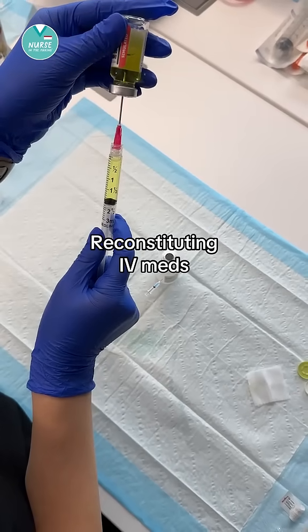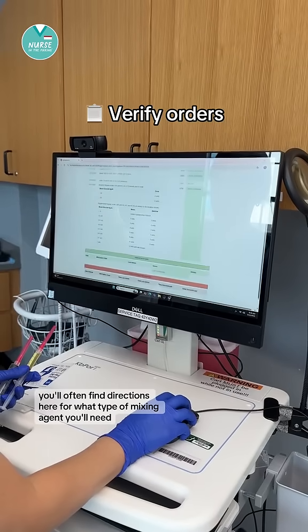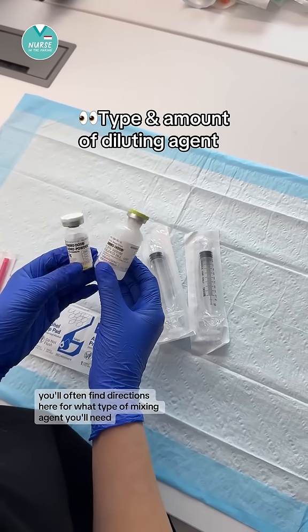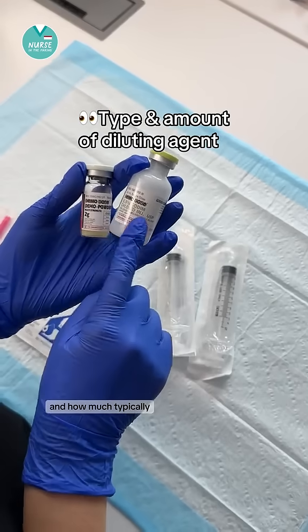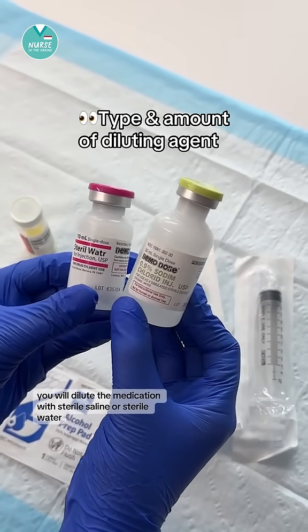Let's reconstitute IV meds. First you want to start by verifying your order in the MAR. You'll often find directions here for what type of mixing agent you'll need and how much. Typically you will dilute the medication with sterile saline or sterile water.